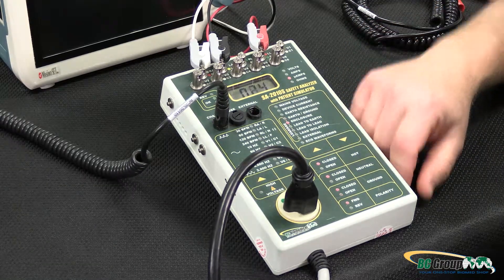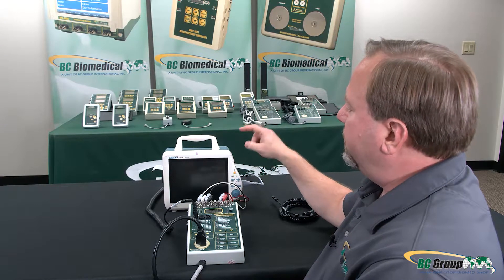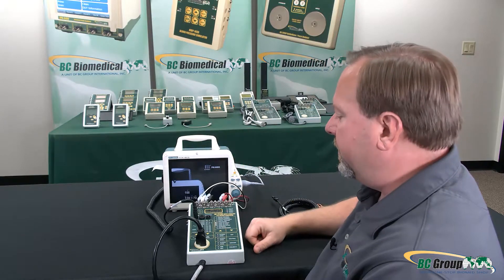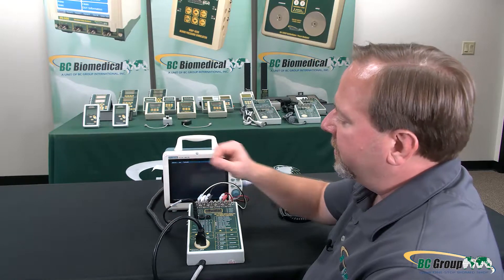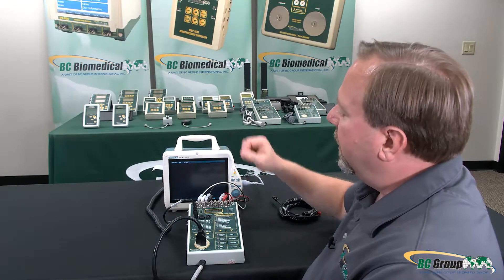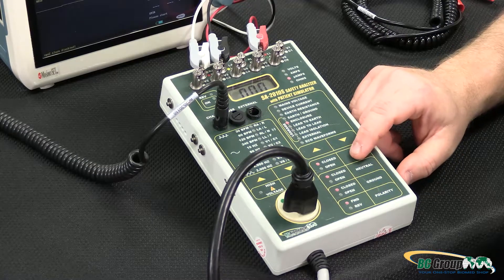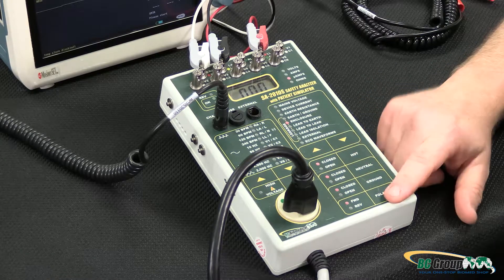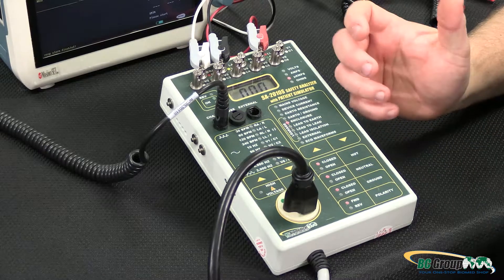Then we can move on to enclosure leakage. In this case we're measuring any touch current we might get by touching the outside enclosure of the device under test. We need our chassis cable plugged in, connected to a ground point on the enclosure. With closed hot, closed neutral, and forward polarity, we have zero microamps.